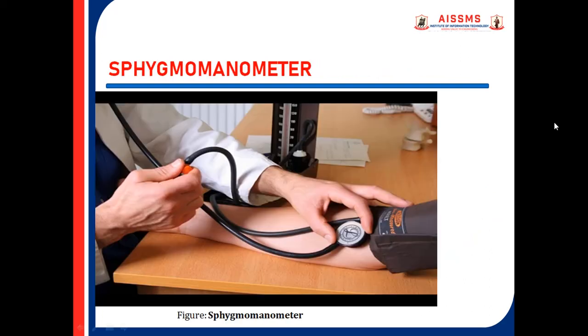Sphygmomanometer. Now we will see how to measure blood pressure. There are two numbers in a blood pressure reading: systolic and diastolic. Initially, put the cuff around the arm and pump it up. This effectively cuts off blood flow with the pressure exerted by the cuff.